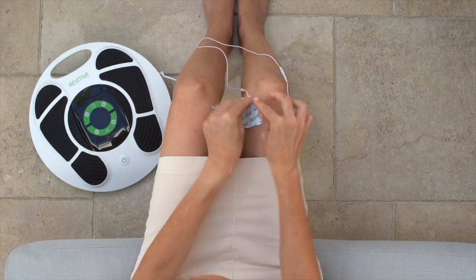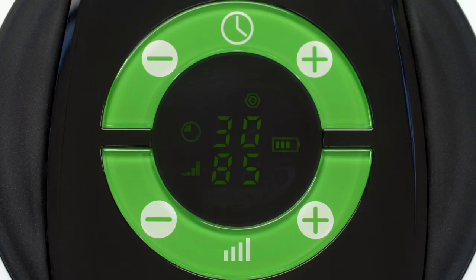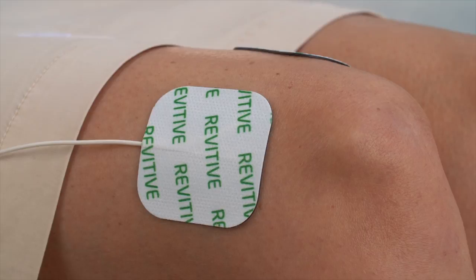Using the remote control, press the TENS button. The time will read 30 minutes and the TENS program symbol will be displayed. Increase the intensity from 1 to 99 until you feel a strong but comfortable tingling sensation.